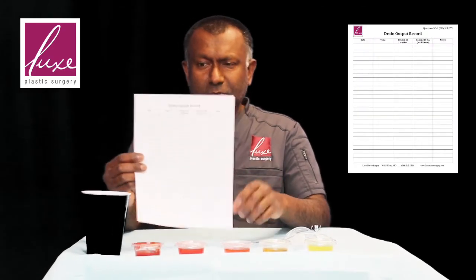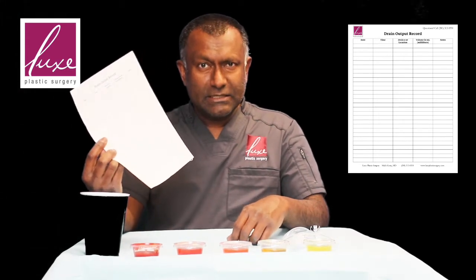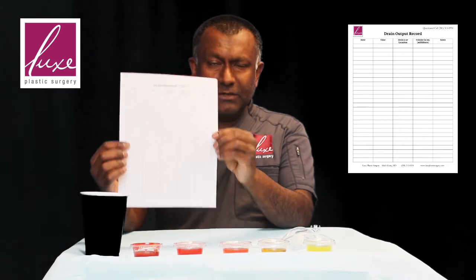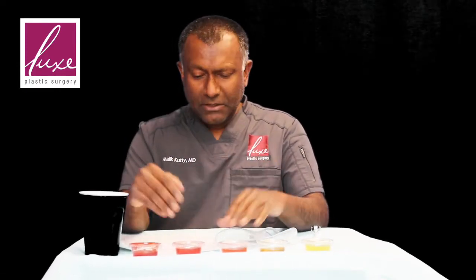This is a drain output record. We'll give this to you either during your pre-op appointment, or you can always find it on the website. You can print it out as a PDF and be very careful about keeping track of everything. When we make your appointment that's around a week out, we're going to have you add up everything that's come out over the prior 24 hours, and that's what I'll base being able to take it out on.